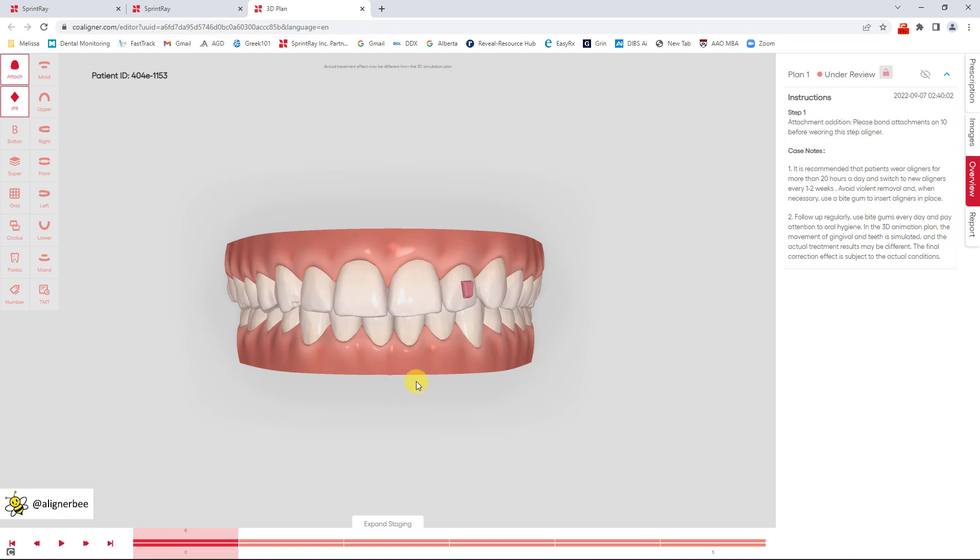When I open the treatment setup we're going to see that I have the treatment simulation. I have a toolbar at the left hand side that allows me to see some of the different features in the treatment setup and the different treatment views.